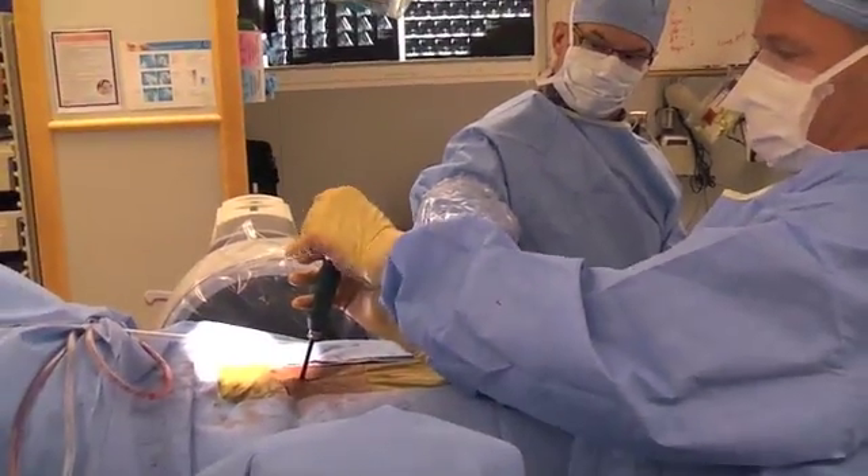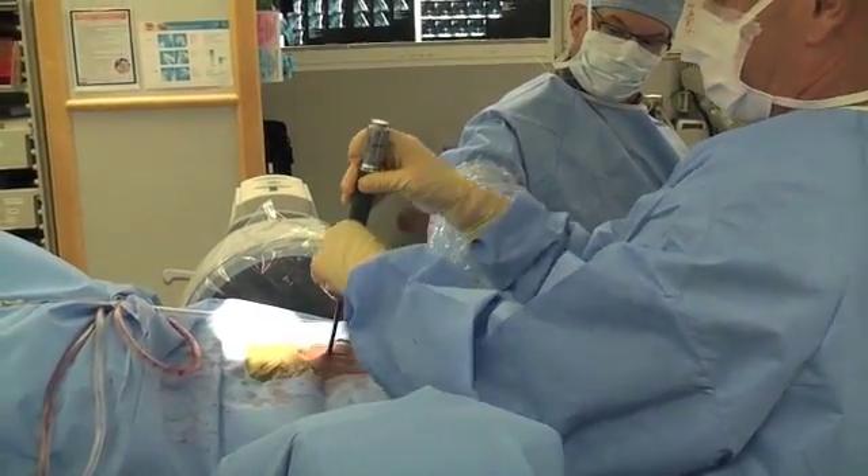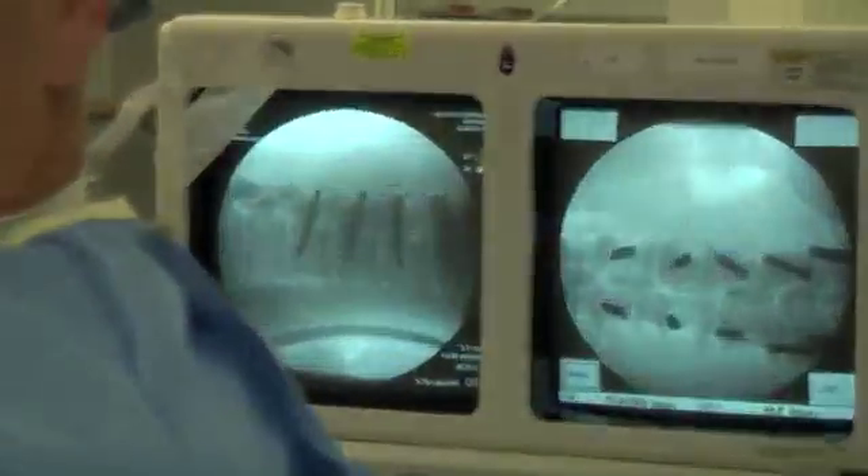We're going to direct it down the tunnel that I created. You can see this blow up — because of the keel, it binds a little. It's got a bulleted tip, and it binds. Keep going, all the way to the front. Loosen it again and turn the corner. There you have it. Then I undo the hinge back to me, pop the hinge, rotate this out, disconnect the handle — and voila. That's the final placement of that interbody graft. That's all there is to it.